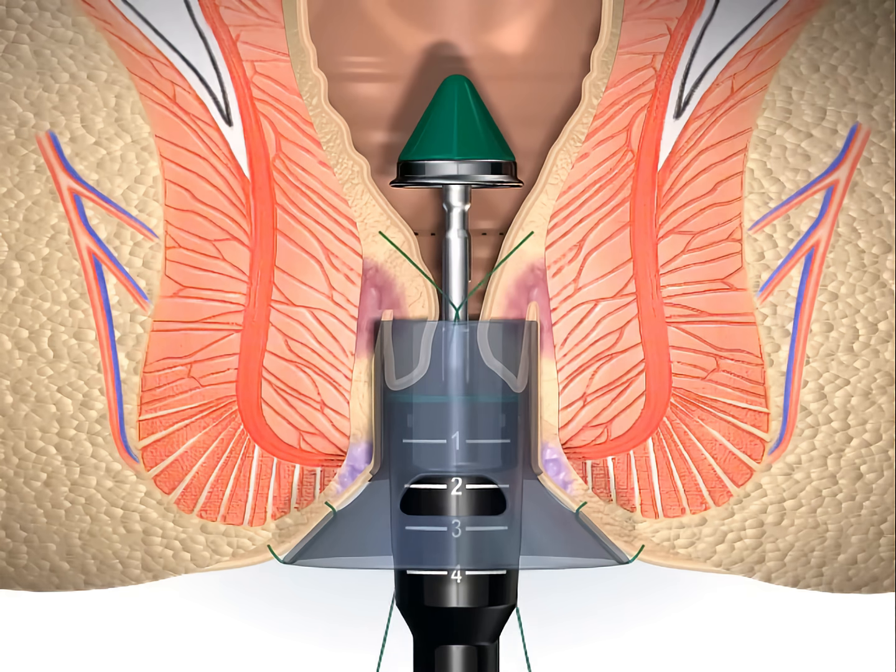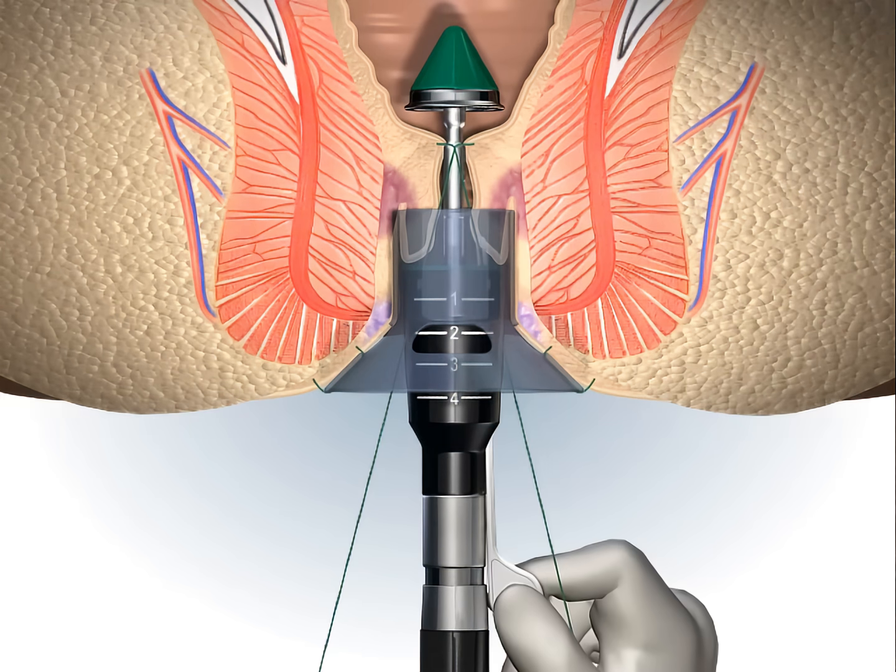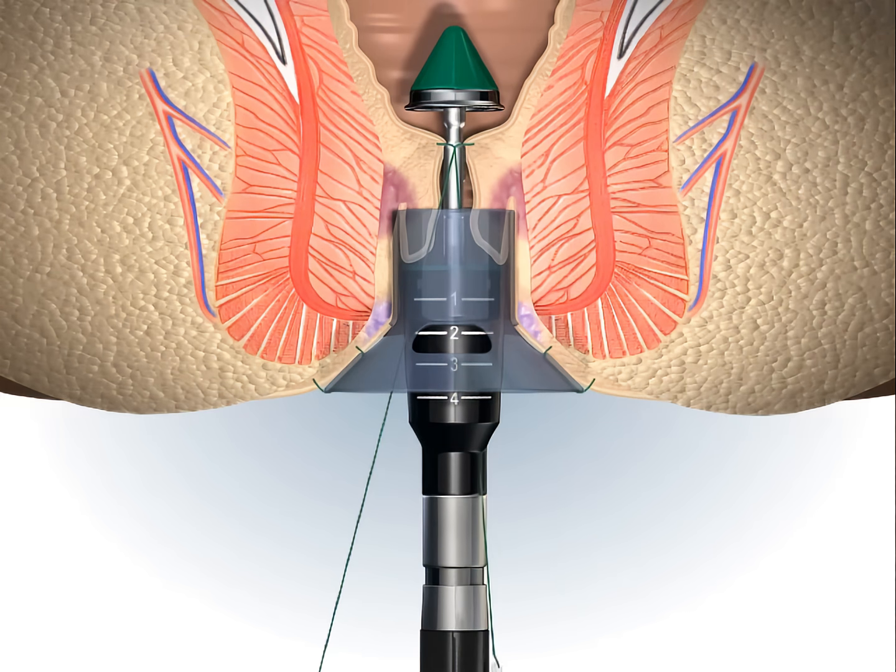A surgical knot is made to secure the tissue onto the anvil shaft and, with the help of the suture threader, the ends of the threads are pulled through the lateral channels of the stapler. The stapler is then partially closed.